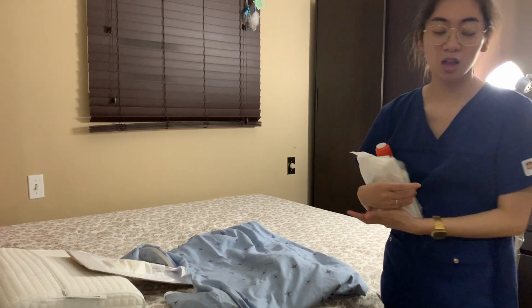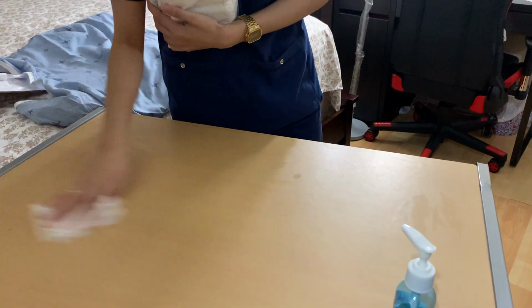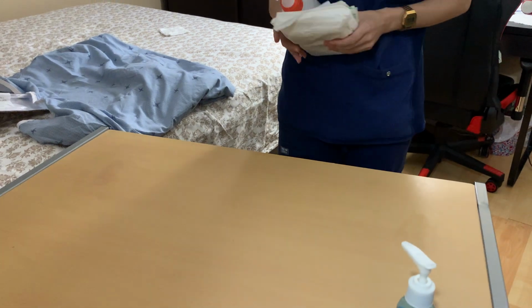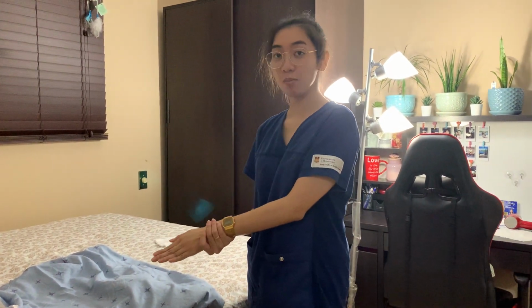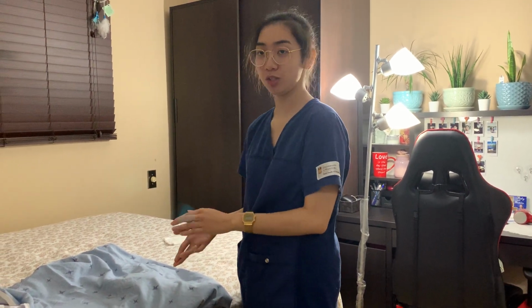No? Perfect. So before I set down my supplies, I'm just going to clean my table. And this is just garbage. And in real life, I will be adjusting my table and my bed to my waist height. I'm also going to make sure that my patient is in a semi-Fowler's position. So now I'm going to explain the procedure to my patient.